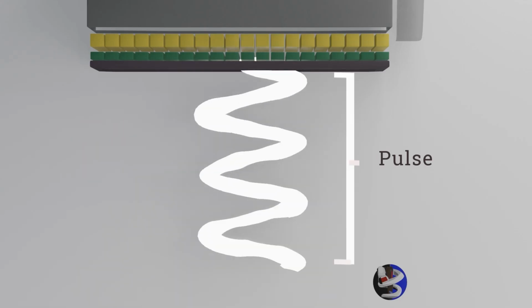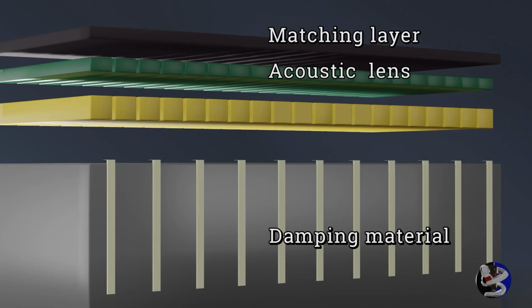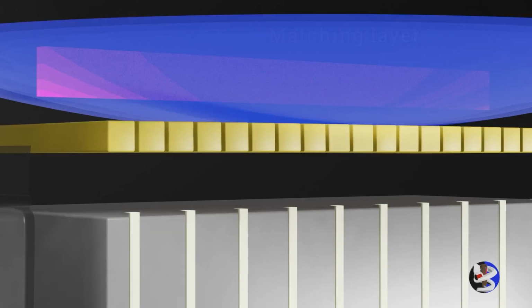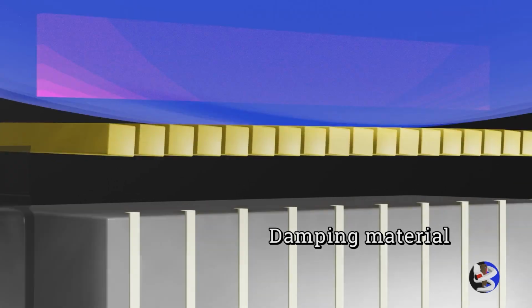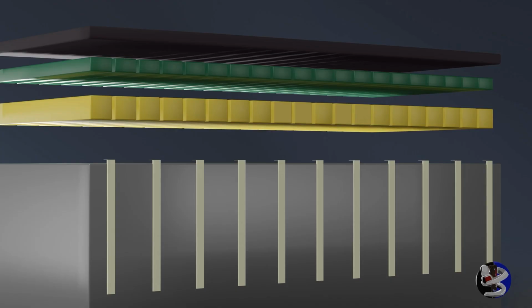of cycles. The piezoelectric element is housed in a transducer, which also contains a damping material, an acoustic lens, and a matching layer. When stimulated, the crystal vibrates in all directions, with the majority coming from the front and back. This is inconvenient since we only need it from the front or the patient's side. The backing material or damping block tries to eliminate vibrations on the back of the crystal and controls the length of vibrations from the front face. That is, it controls the number of cycles emitted in a single pulse.